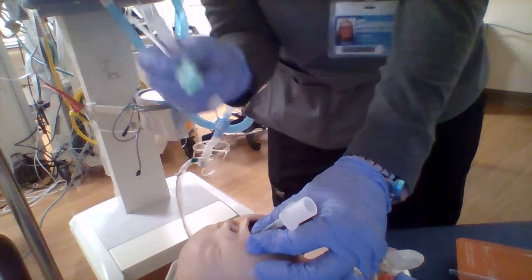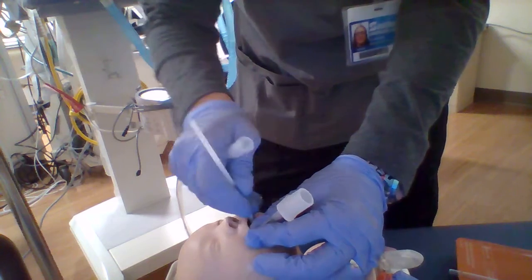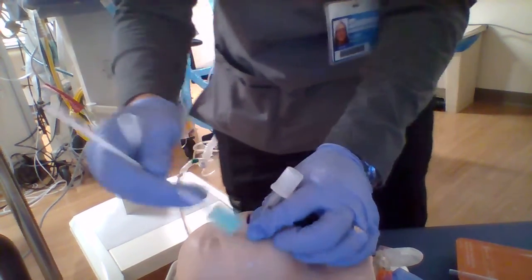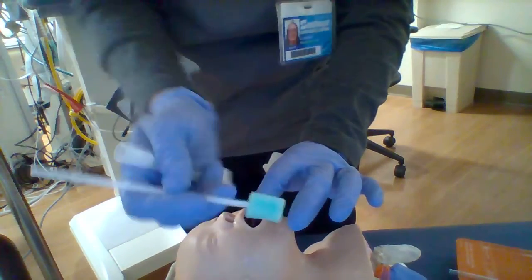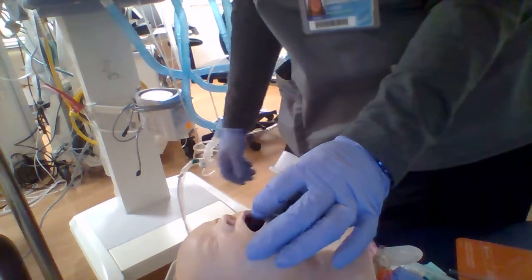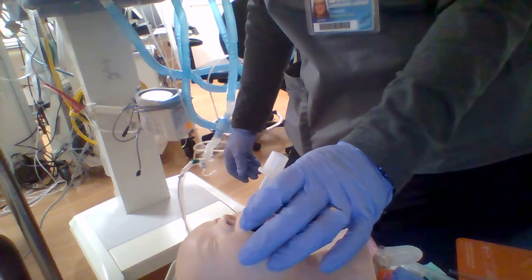You also have these handy guys, some of which you can suction with as well. And shove that down in there. It just kind of helps. These really just help get the crusty stuff off the mouth and stuff like that. So we'll switch sides and do the same thing on the other side of the mouth. They do like to move the ET tubes here pretty often every time you do your checks and check your cuff pressure and all of that good stuff.